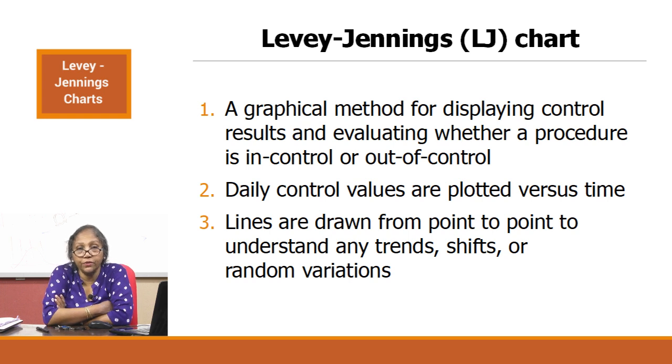Just to get started on having an LJ graph in your lab, how will you get started? We'll explain once again the sequence of things that you need to do. We need to again understand that the LJ graph is a graphical method for displaying the control results and evaluating whether the procedure is in control or out of control. Daily control values should be plotted against time, and lines are drawn from one data point to the next data point to understand if there are any trends or shifts or random errors happening in your system.